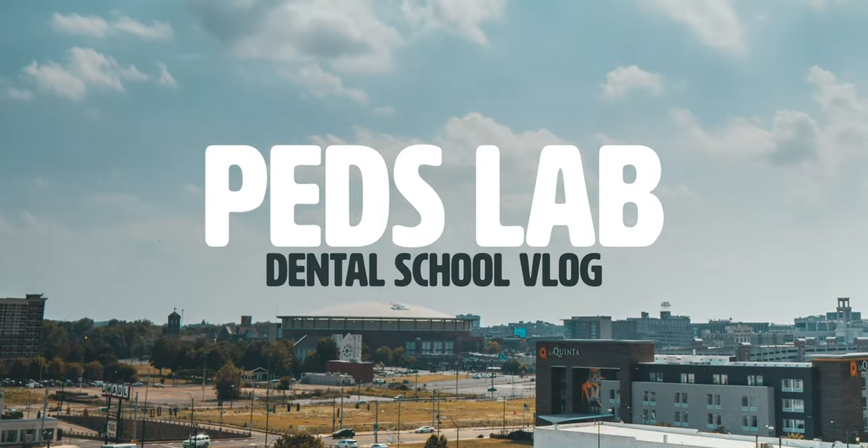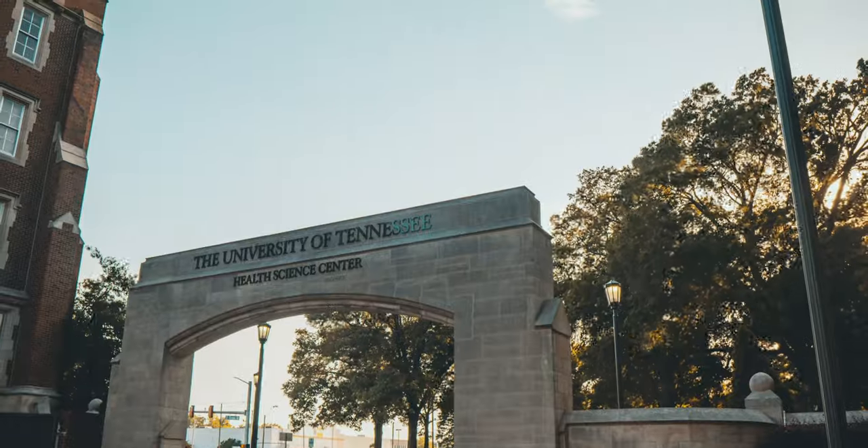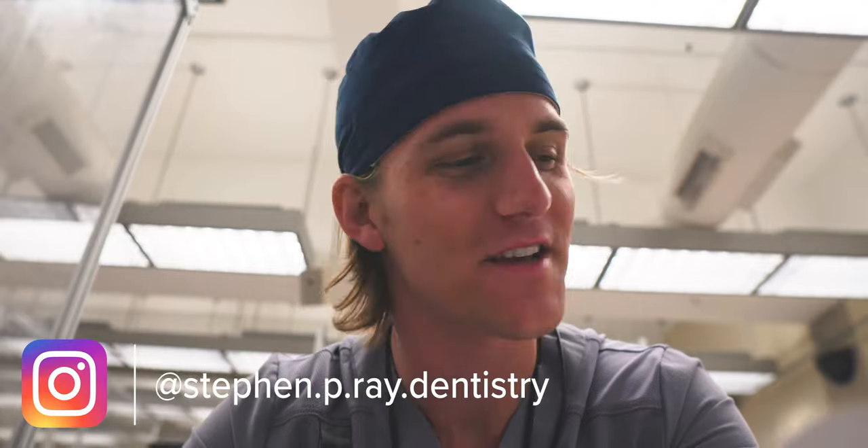Hey friends, welcome back to the channel. Today I am bringing you along with me to our pediatric dentistry labs. We have a full slate of assignments to do for peds lab, so this should be interesting. I'm finishing up some composite restorations as well as our stainless steel crown, which should be fun to show you. We also have a bunch of amalgam restorations and more stainless steel crowns. This is the first time I'll be taking you through our peds lab — it's a new lab for us, but so far it's been pretty fun. There should be some good shenanigans going on as always, so let's get started.